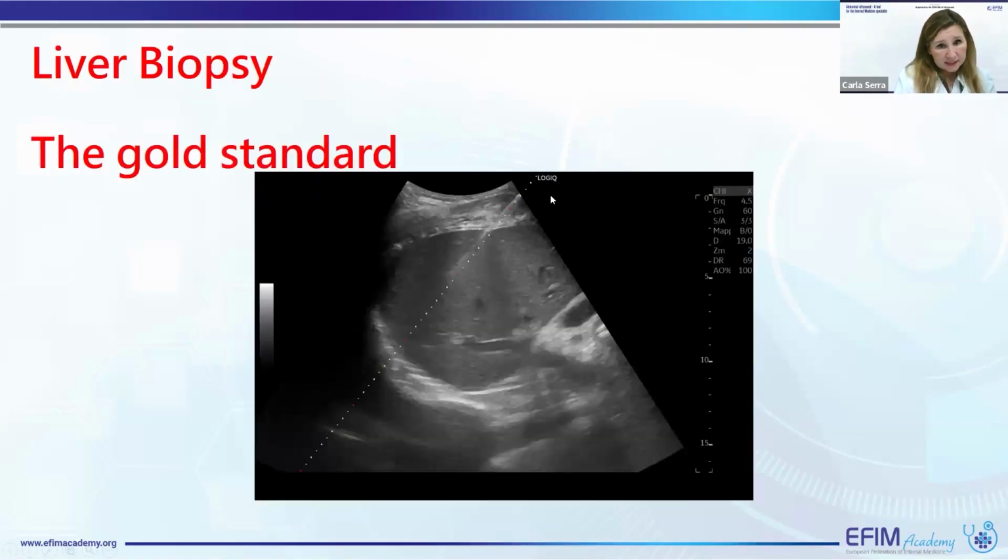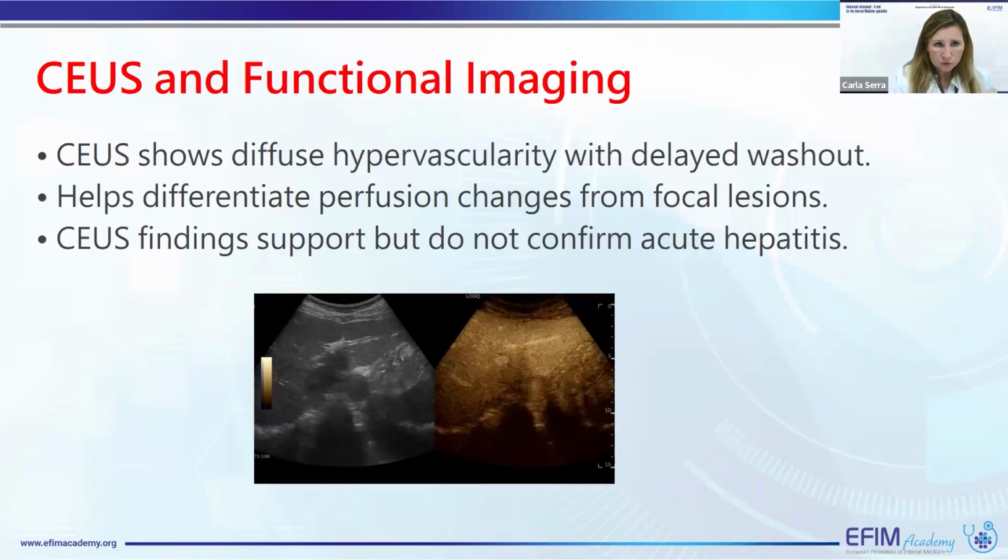And it's important also to use ultrasound, as I mentioned before at the beginning, to perform liver biopsy, that in many cases can help you to make the final diagnosis.